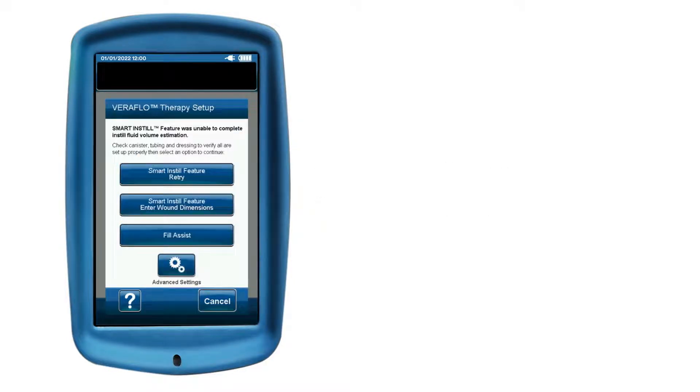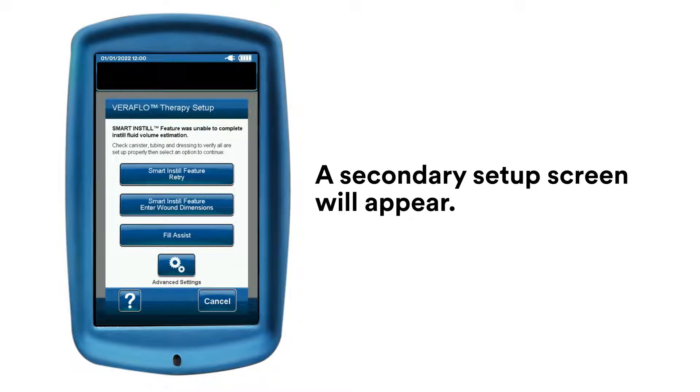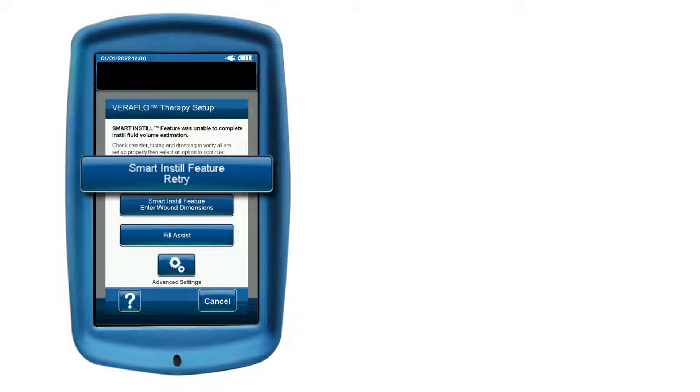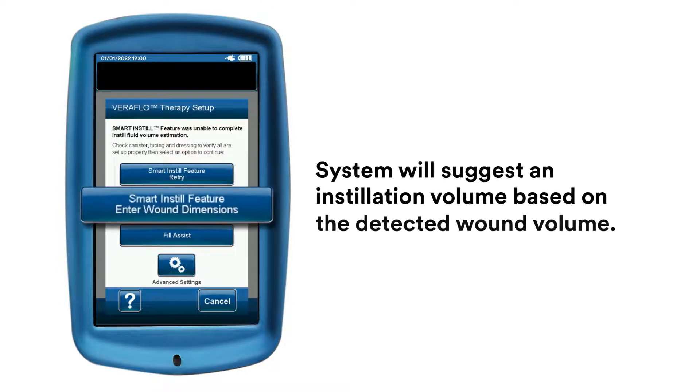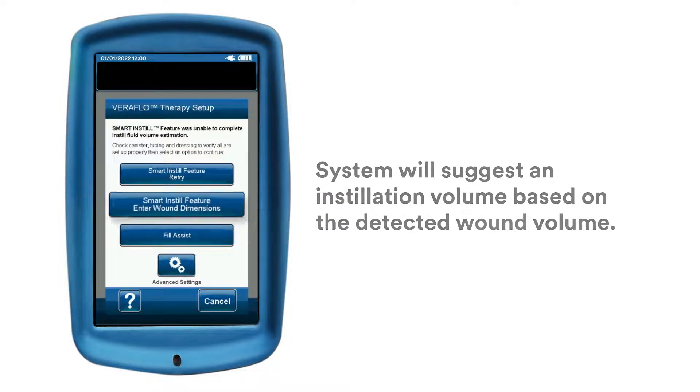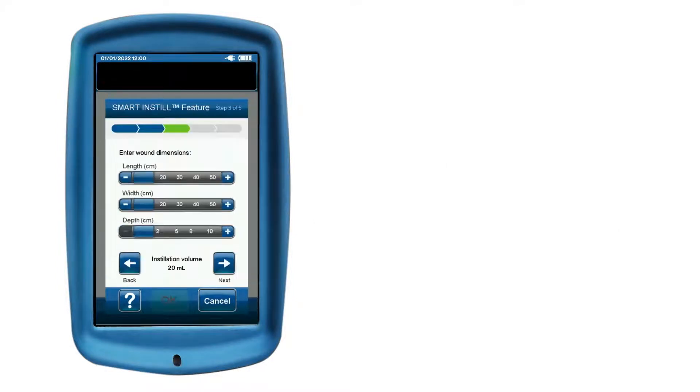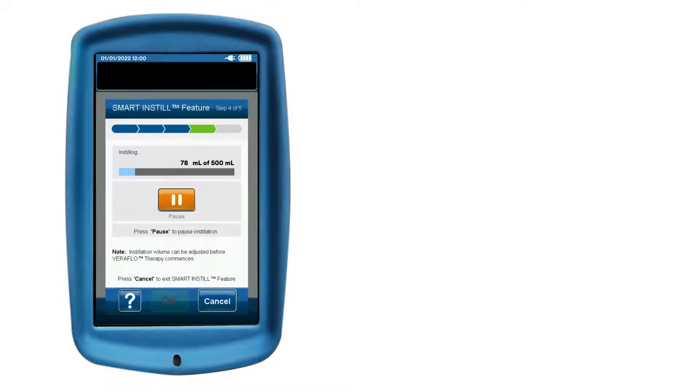If the setup was unable to complete the instillation volume estimation, a secondary setup screen will appear. At this point, you may select Feature Retry to restart the automated Smart Instill feature process, enter wound dimensions for manual entry, use the Fill Assist feature, or enter the solution volume manually. After you have successfully set up VeriFlow Therapy, the selected therapy settings will be delivered.